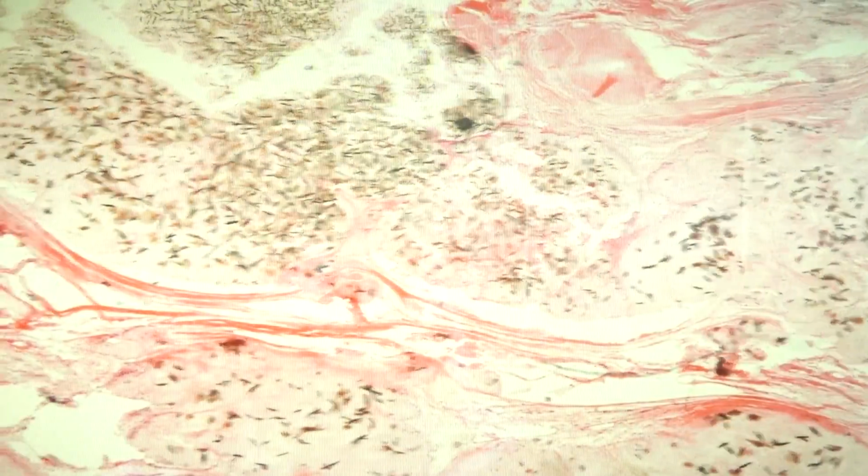Next we have gout. This is slide 13. This one is very easy to identify, as you can readily see the presence of the crystals. Gout is a lesion caused by deposition of monosodium urate crystals in different areas of the body, and this is associated with hyperuricemia. Although when we have patients with hyperuricemia, it may not lead to gout.